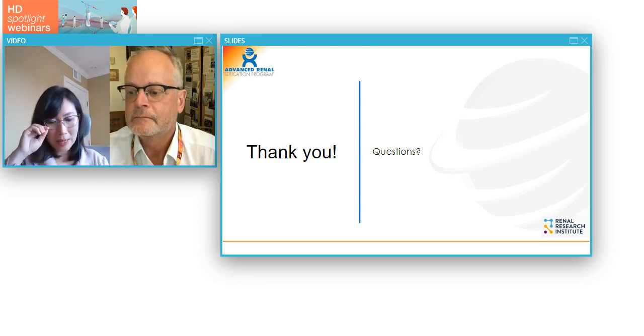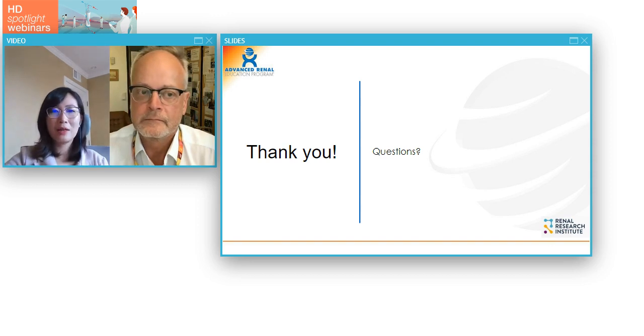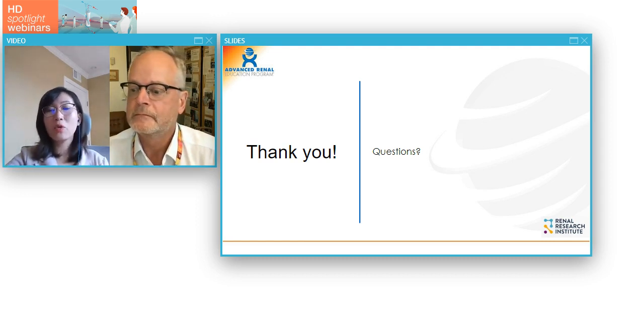This is one of the examples, and there are other methods like changing the ionic strength of the dialysate content, because the binding also depends on the ionic strength. If you change the ionic strength, there could be more free fraction of those toxins mobilized into the dialysate. In this case, you have better removal. But this method may have some hemocompatibility issues, and I think there will be more testing to be done. And I think there are also more mature methods like the plasma separation method.